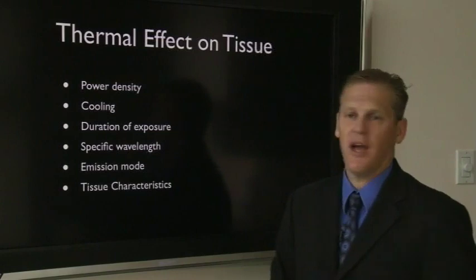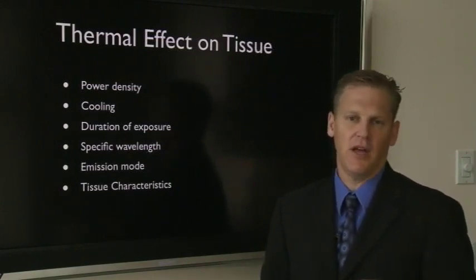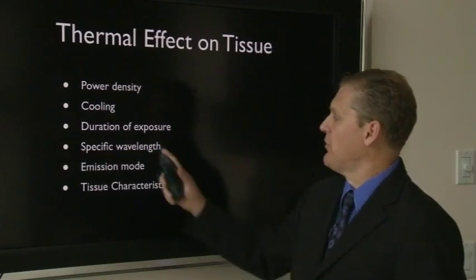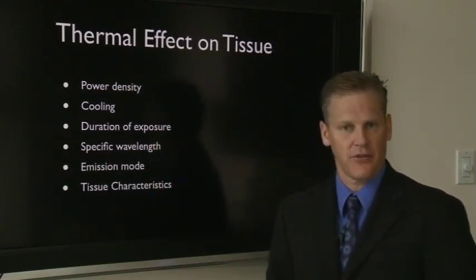Duration of exposure. As I mentioned, the longer that you leave the laser on, the greater the effect. And you want to use the minimal amount of energy and time in accomplishing the procedure. The specific wavelength, you will find that some wavelengths penetrate deeper than others.